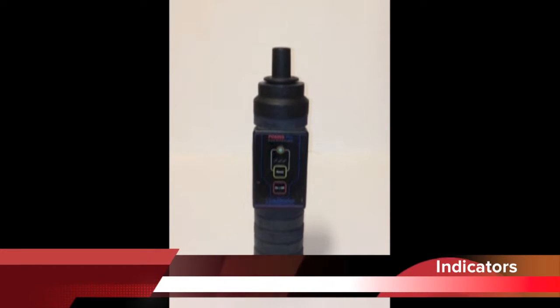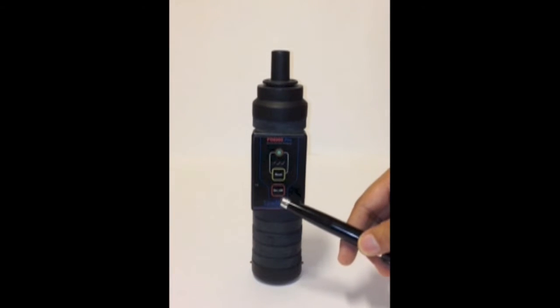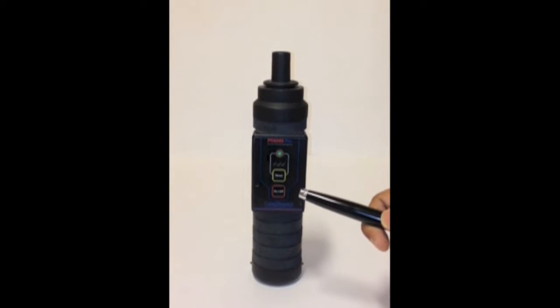We will now demonstrate the indicators of the PD6000 Pro model to you. Beginning with the on and off switch, as you can see, this switch turns the instrument on and off. It's a push-to-on, push-to-off switch.